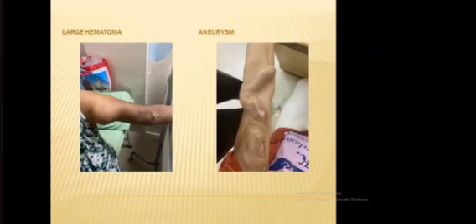And this is multiple surgery. You can see the scars of multiple surgeries for AV fistula in a patient, one at the distal part, one in the middle of the forearm, and also at the brachiocephalic side. Finally, a permacath was placed and he was doing dialysis through the permacath. These are the cannulation procedures.